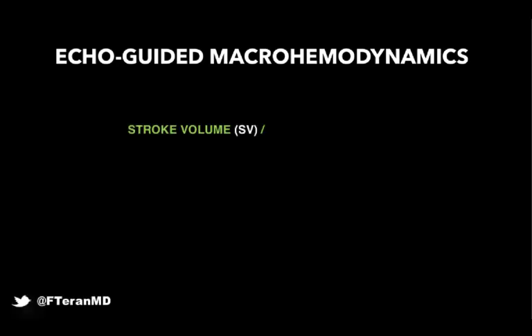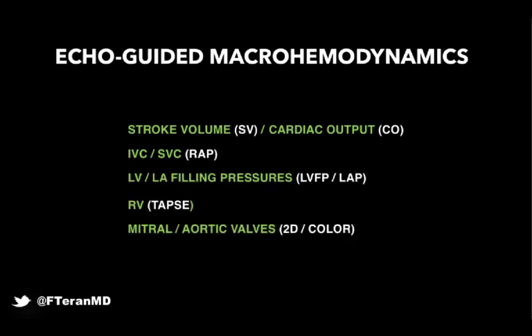And the elements that we're going to use to assess that are contained here. You'll see I don't have a mnemonic like HIMAP or anything like that, and that's on purpose. I think this is something that you're not going to learn. You're not going to walk out today knowing how to do this. What I want to do today is to introduce a concept, and I want to inspire you to go back to your patients and start applying this, start building this additional skill set to be able to do this. This will require some understanding and integration of some, if you will, more advanced physiologic concepts that we don't often maybe think about.